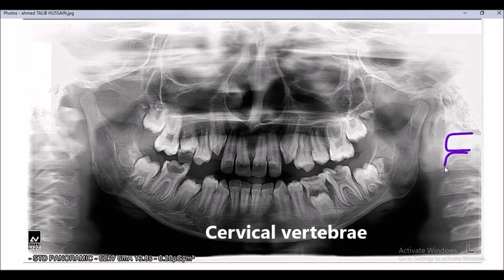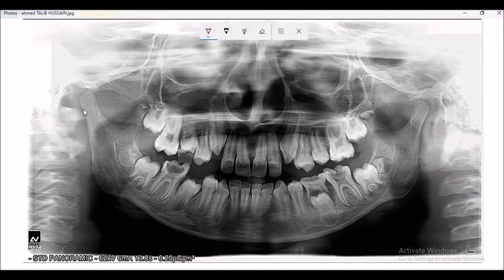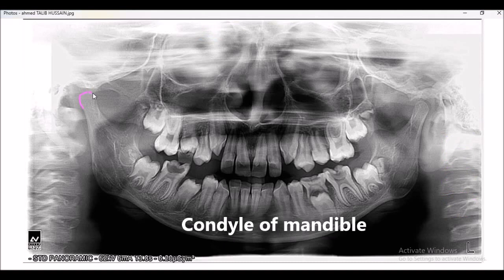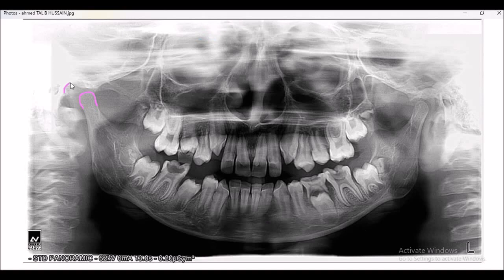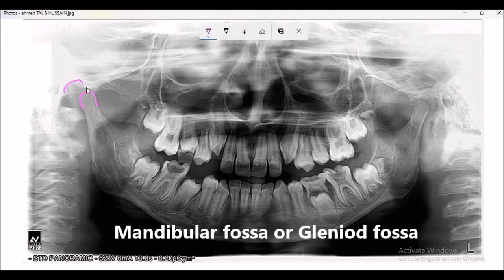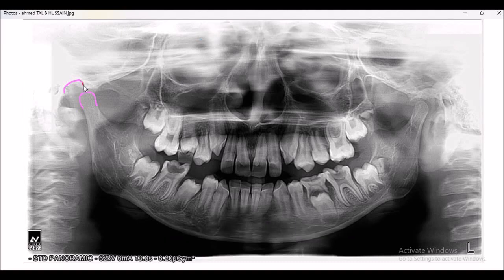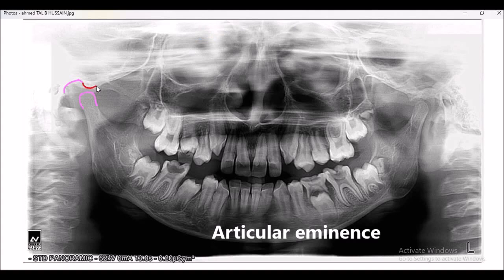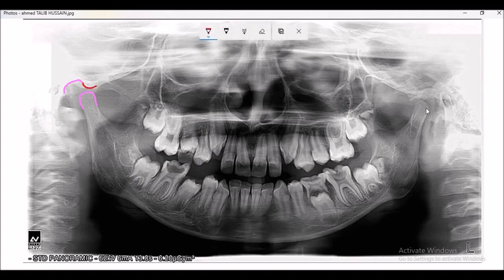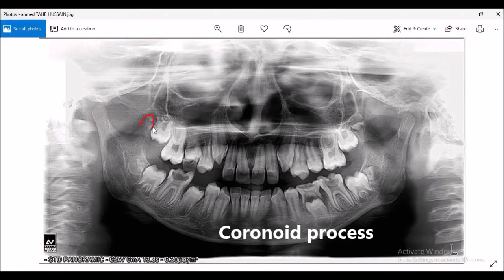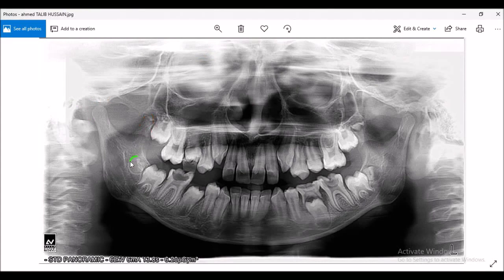These are the cervical vertebrae. This is the condyle of the mandible. This is the mandibular fossa, sometimes referred to as the glenoid fossa. And this surface is known as the articular eminence.